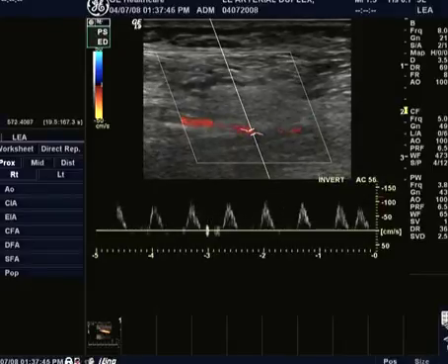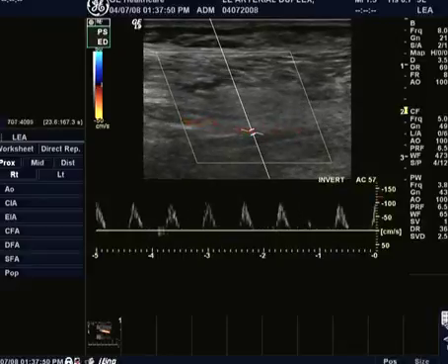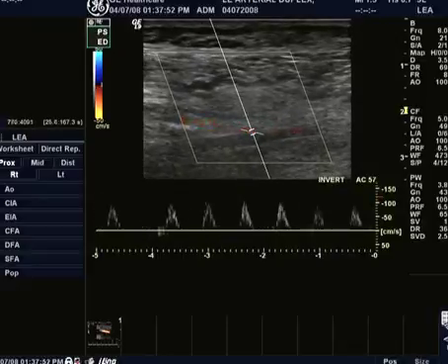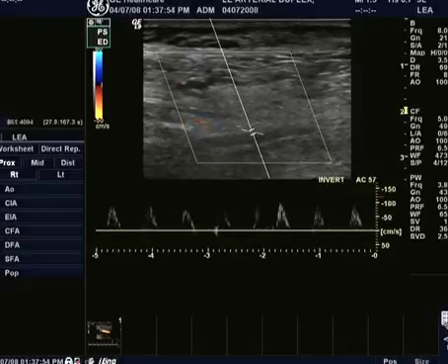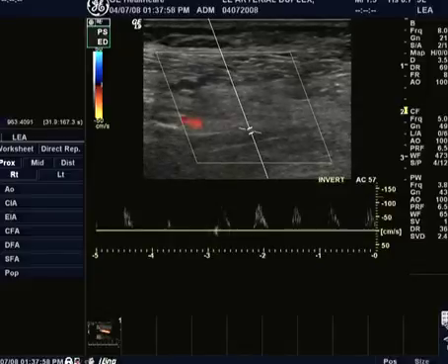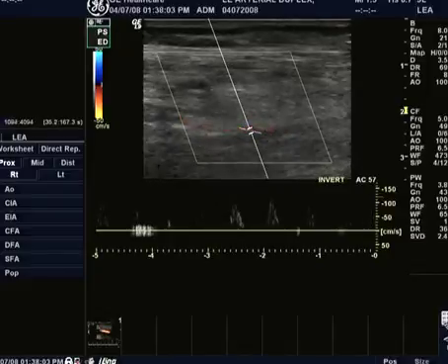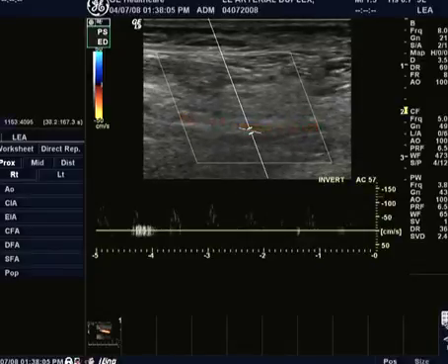We're at 56 degrees, so we can even play a little bit better, because believe me, when you go back and look at these things, you'll be amazed at how close you thought you were and how far off you really were. But I think this is pretty good. Let me just see if I can get a really good shot here.